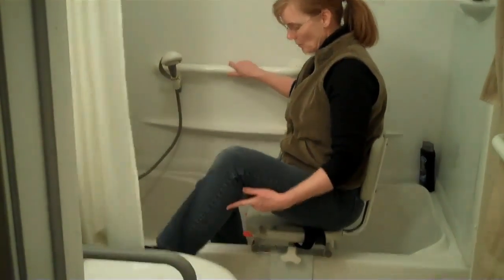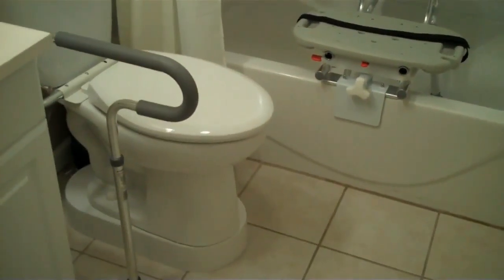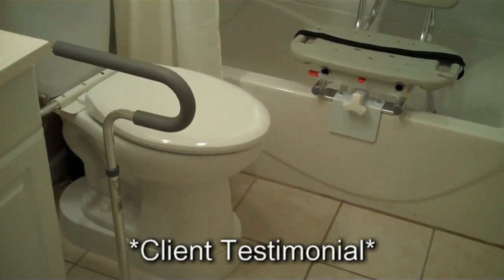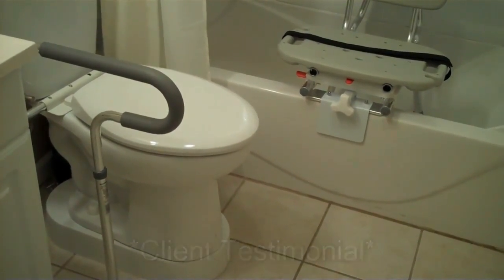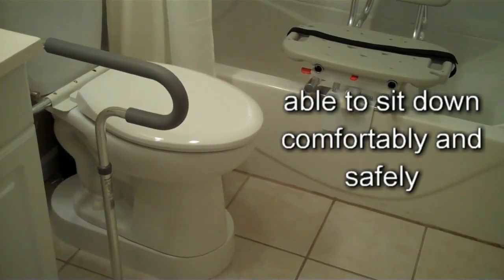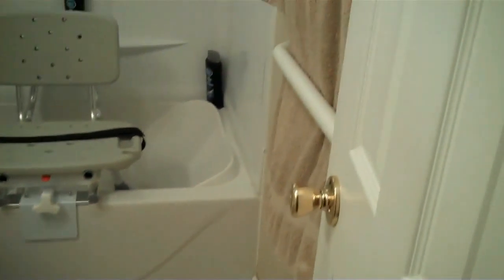So how is the toilet seat arrangement — with the toilevator and using just one side of the toilet safety frame — working for you? As far as my disability on the right side, being able to sit down comfortably and safely, it's working out great. With the hand railing and the raised toilet height, it's working out excellent.